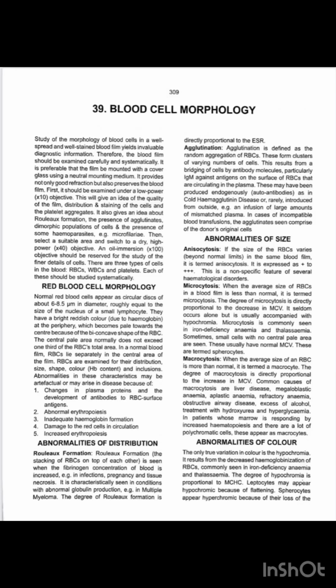Bismillahirrahmanirrahim. The topic of today's discussion is blood cell morphology. In blood cell morphology, first of all, we would read why we study the morphology. Morphology of the blood cells is mandatory for diagnostic information.